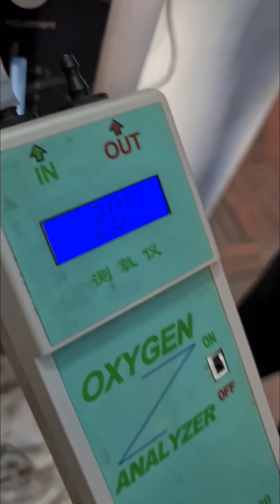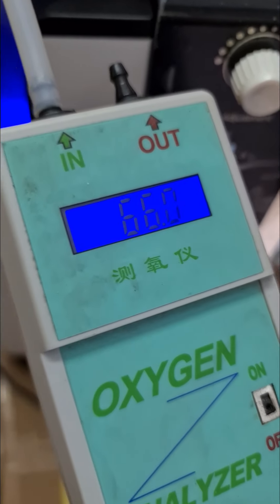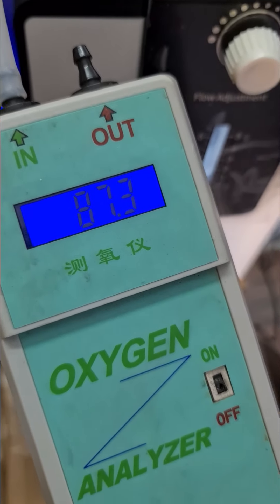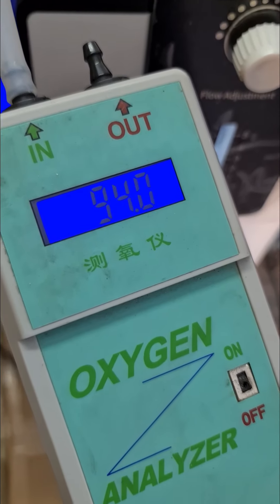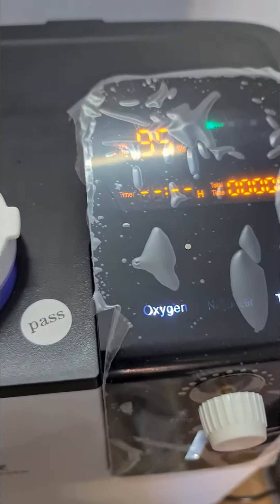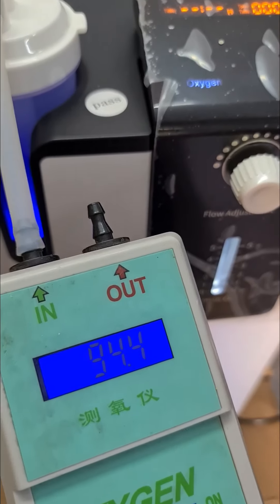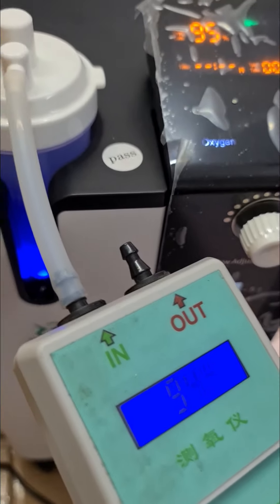Now he is taking an industrial oxygen analyzer to check the output. You can see that even at 5 litres flow rate, the machine is giving 94.4%, which gets rounded off and shown as 95%. So you can use it very comfortably — it will be very useful for all situations at home.